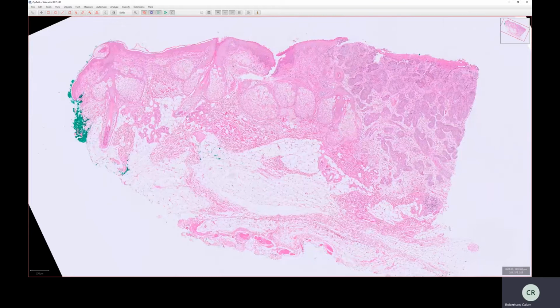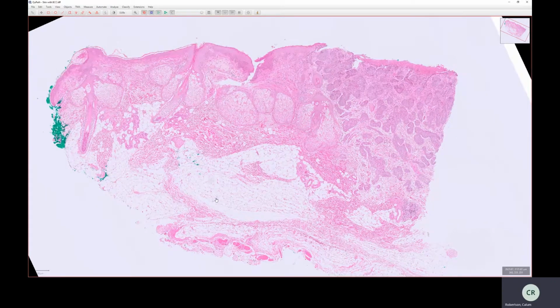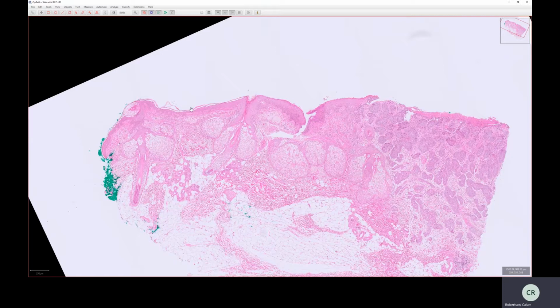And that's everything from up here. Obviously, we've got a bit of an undulating lower dermal border here. But everything below that is fat. And here we've got skeletal muscle. So once you get to skeletal muscle or fascia or something that's no longer fat, you're no longer in skin. Essentially, you're on the deep tissue below the skin. So let's talk about these in order. So let's start with the epidermis.